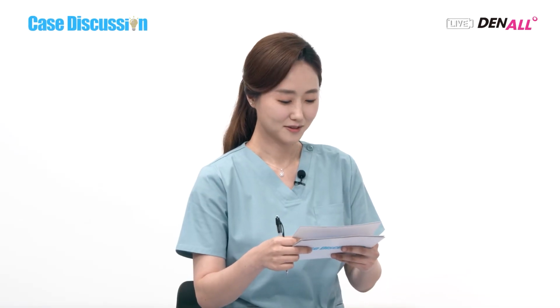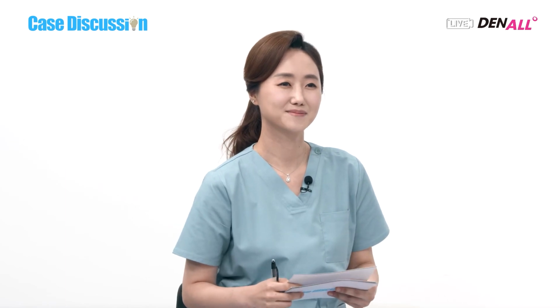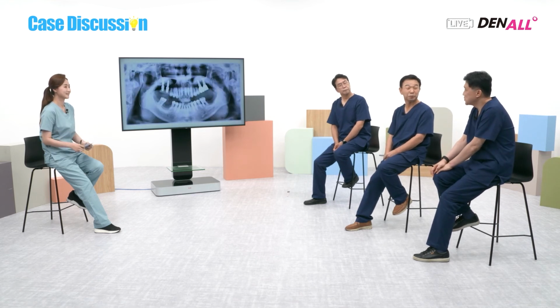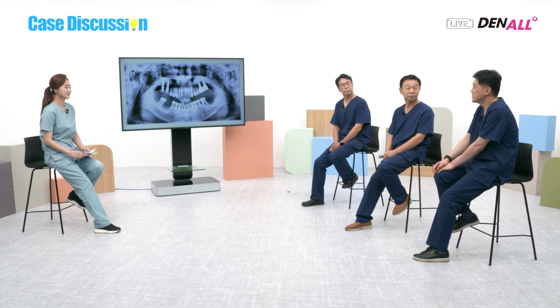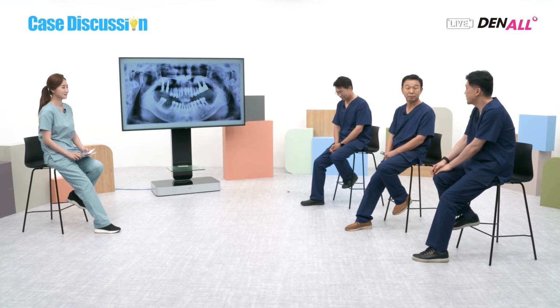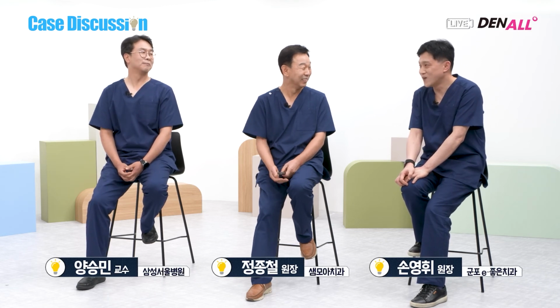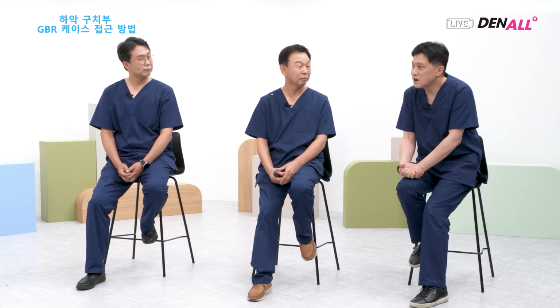Thank you very much. Dr. Son Young-hui, do you have anything to add? Vertically, the vertical deficient ridge is always challenging for us. I use a very similar approach to Dr. Jong's approach. And I have a question for Dr. Jong. When you use a smart builder, what kind of graft material do you prefer?